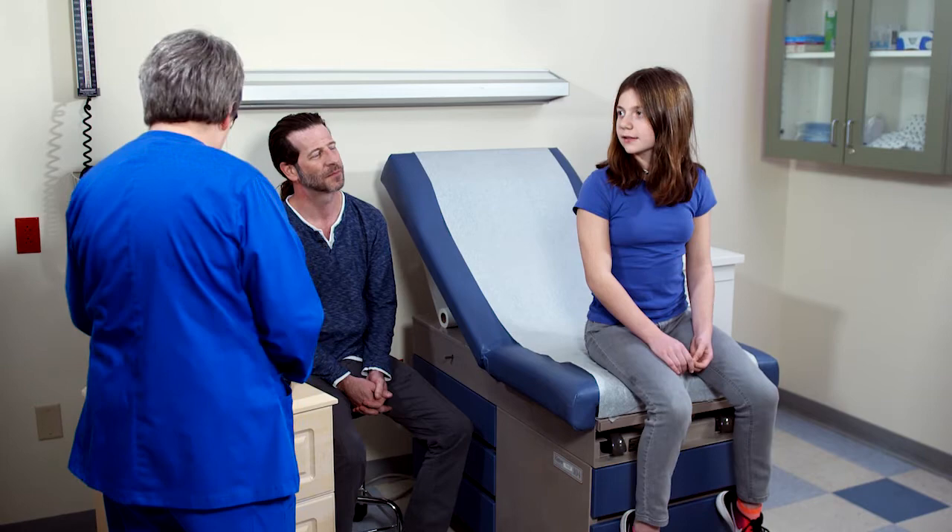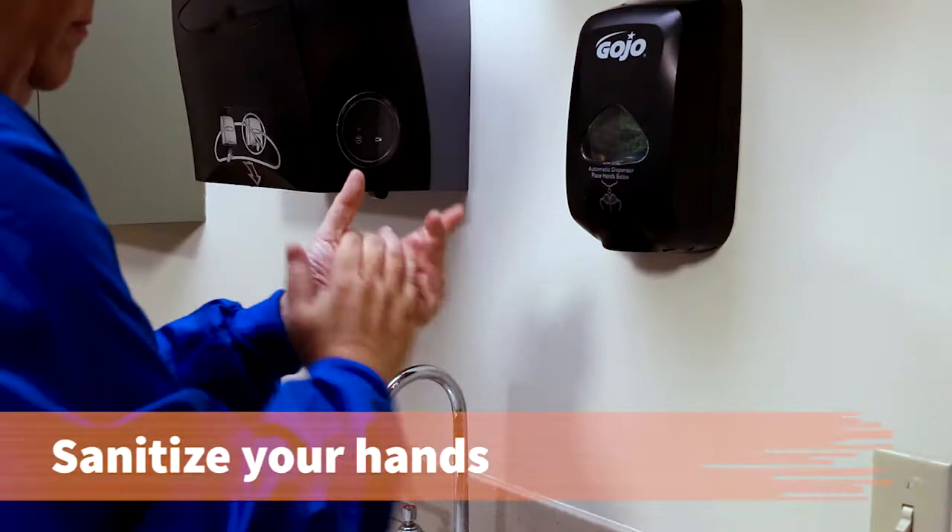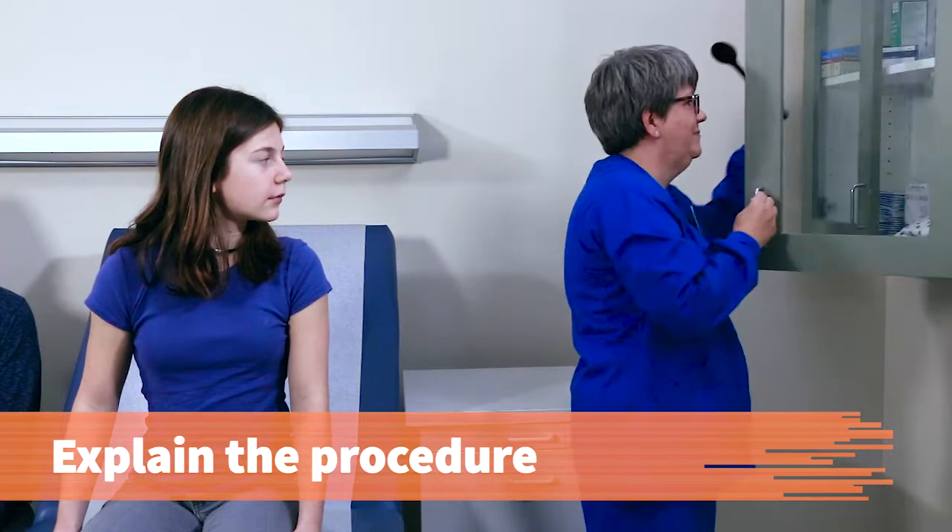Can I get your full name and date of birth? Jubilee Lane Houts. To make sure you have the correct patient, identify the patient by name and date of birth. Sanitize your hands.